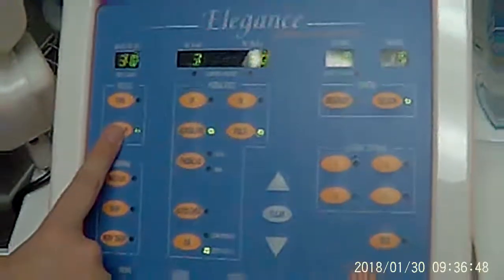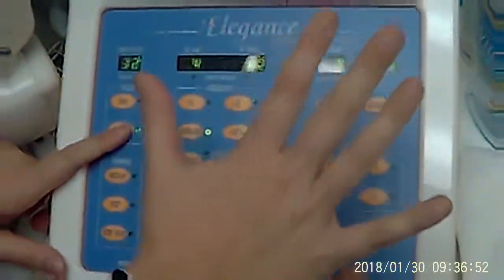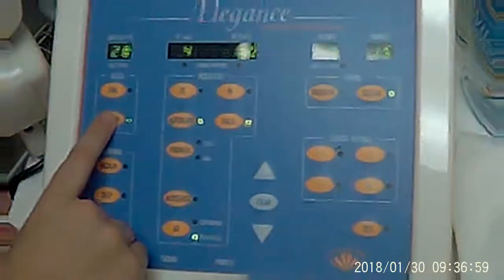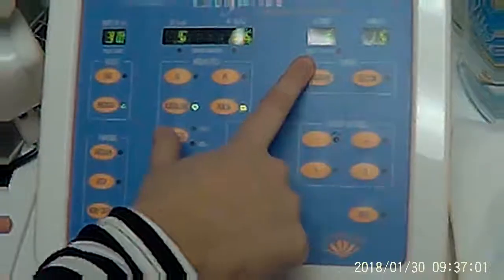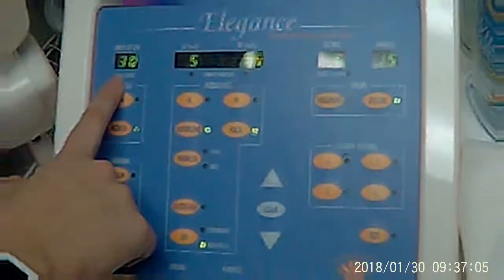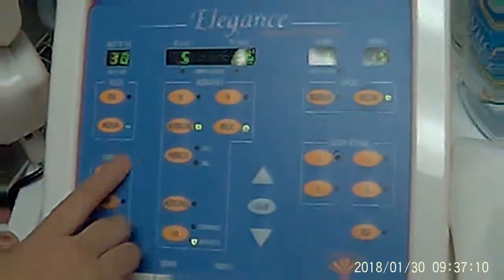Say we're doing medium. You never want to do 10 seconds unless the person is absolutely in intolerable pain — and you get a few like that, sometimes it's men. Go down to six. And then 0.5 gives you 30 units of light. And again, about 5 to 10 units, it's 35 RF.